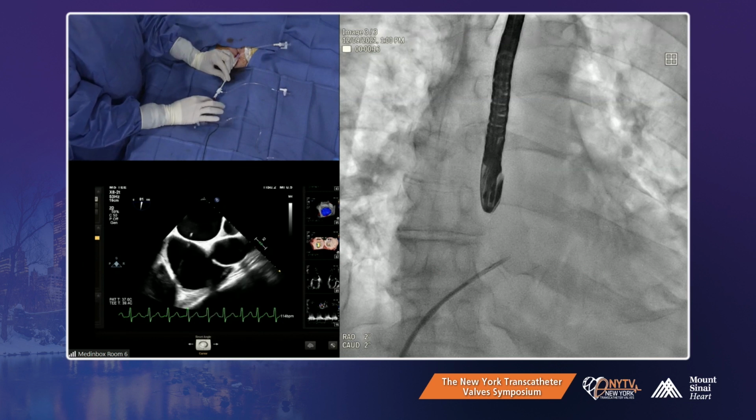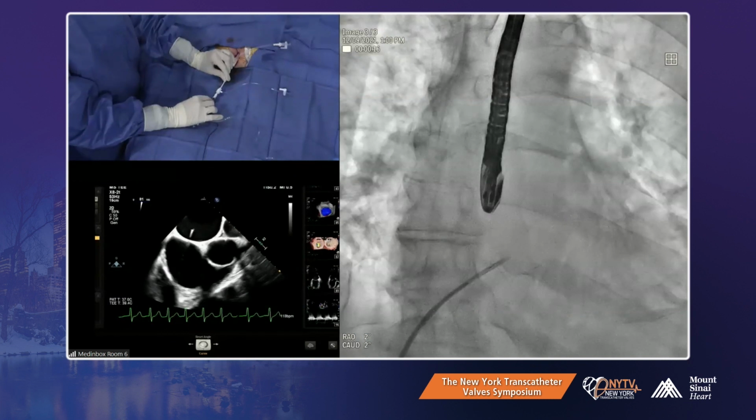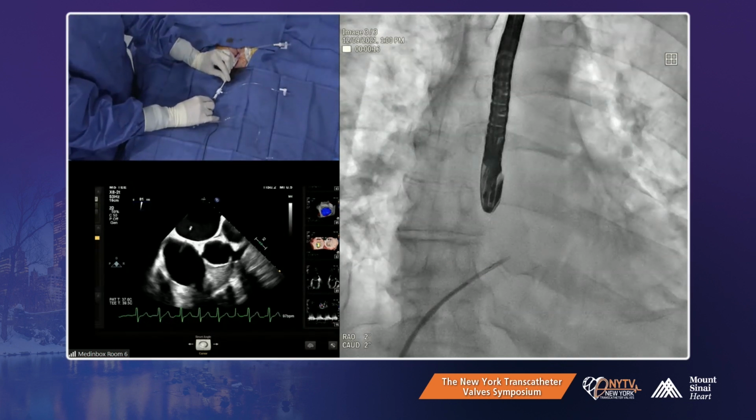Push and hold. Maybe you should have a transapical heparin? More heparin? Mitral valve replacement. We just gave 2,000. No, I'm being sarcastic. He's being sarcastic. Yeah, this should be a transseptal mitral valve replacement. No. Okay, I think, of course, it's TIA.